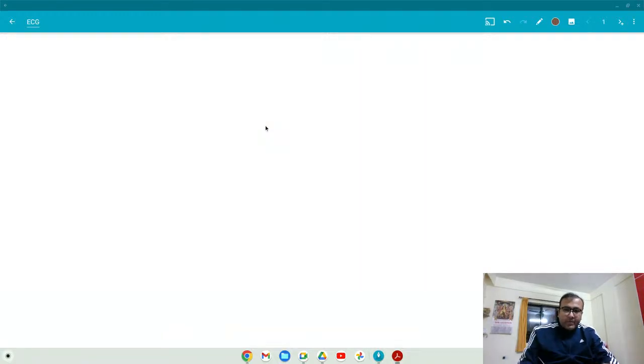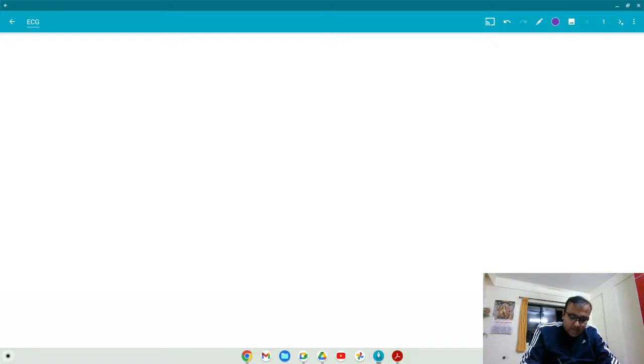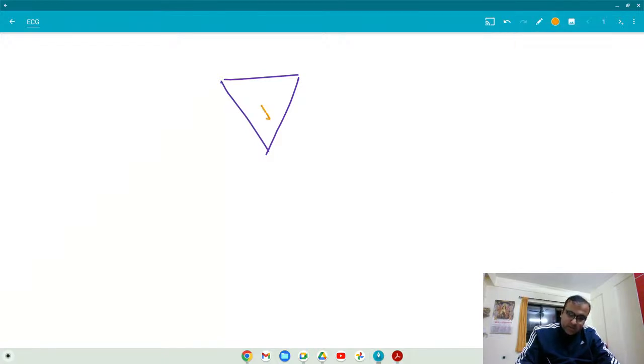Okay. So I'll consider a situation. Let's say this is the cardiac triangle in which this is the direction. Now, you are going to tell me that I have made lead 1, lead 2, and lead 3. Only these electrodes.